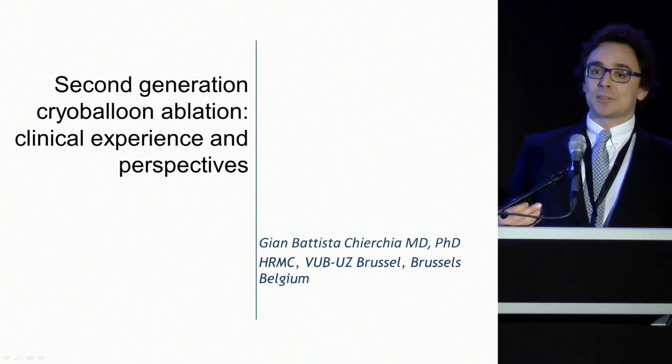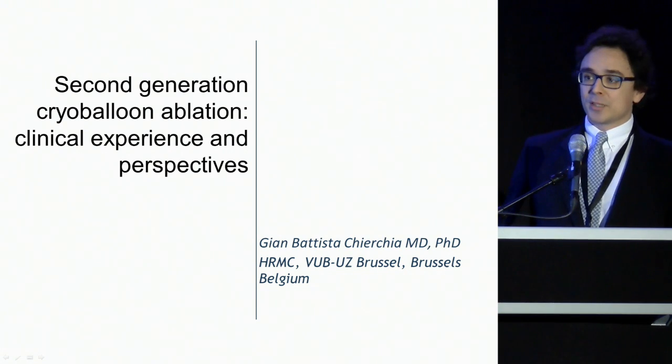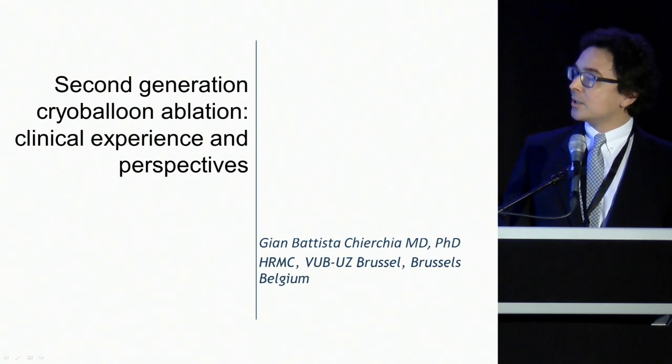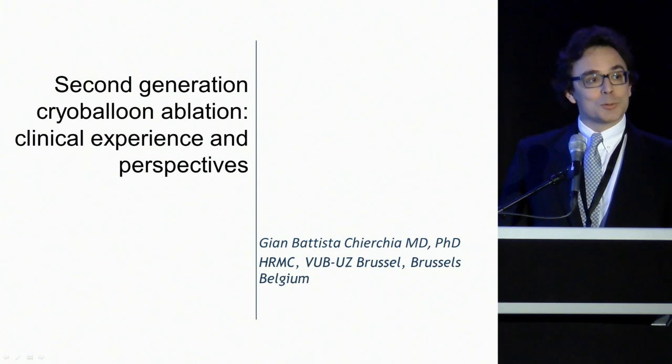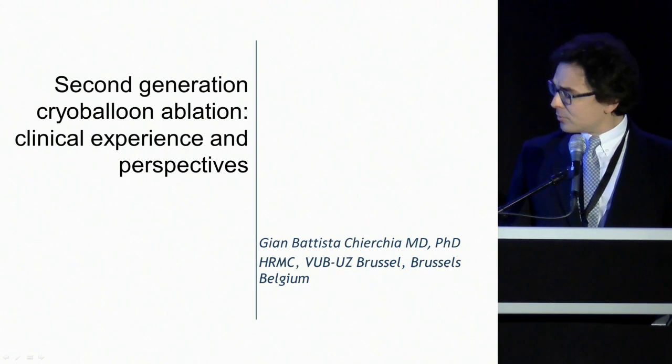So when I was asked to talk about cryoablation of atrial fibrillation, today cryoablation of atrial fibrillation should be changed to cryoballoon ablation of atrial fibrillation, because nobody even thinks of performing a focal cryothermal ablation on the left side due to the length of the procedure this would carry with.